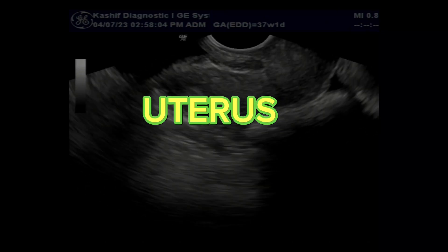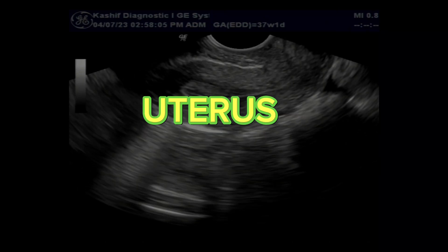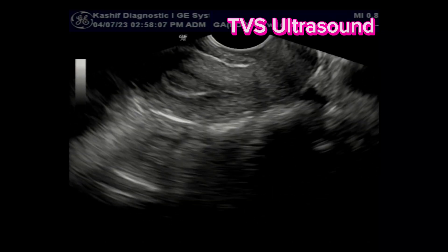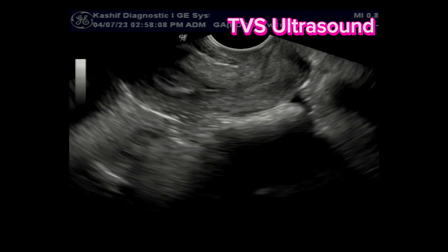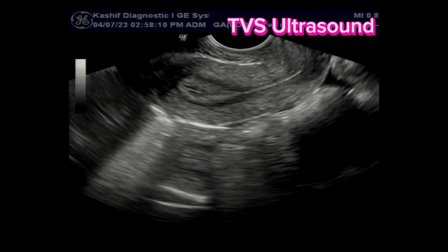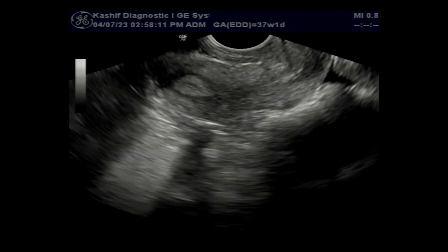This is a TVS ultrasound of a 29-year-old female with a history of recent onset of pain in the lower abdomen and pelvis.